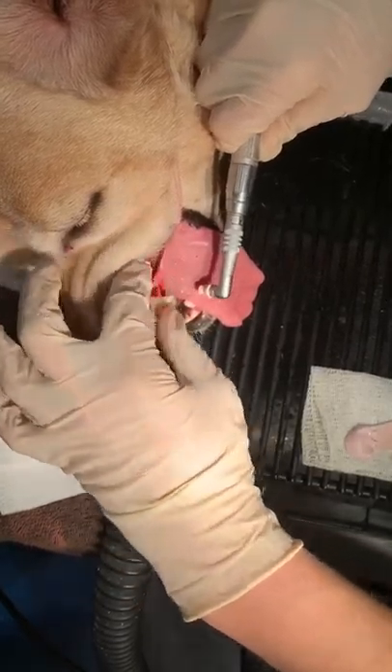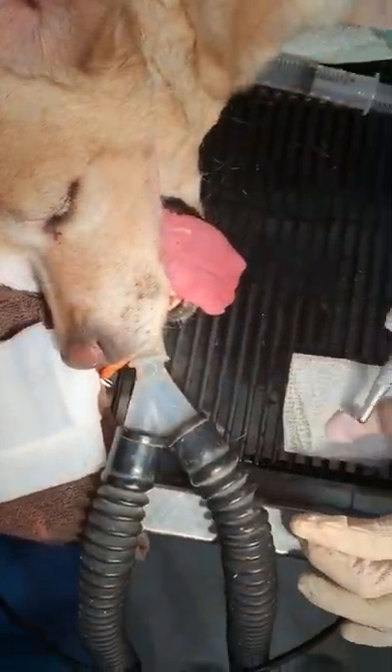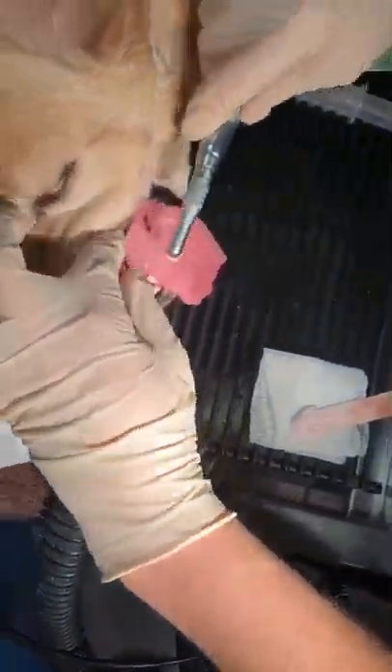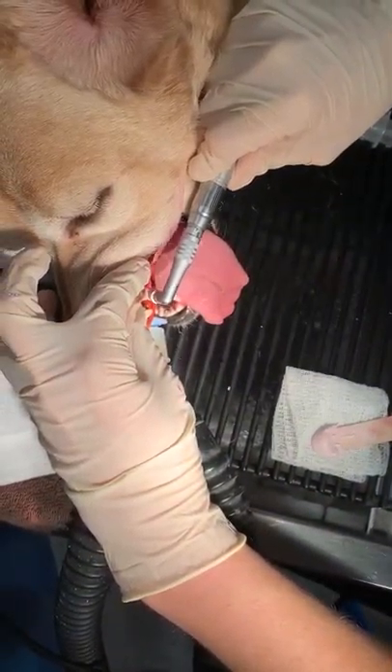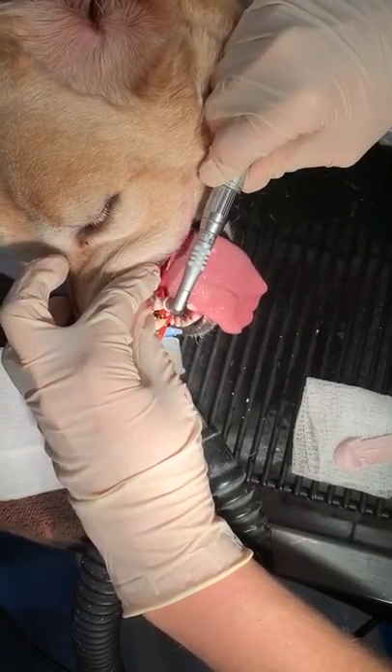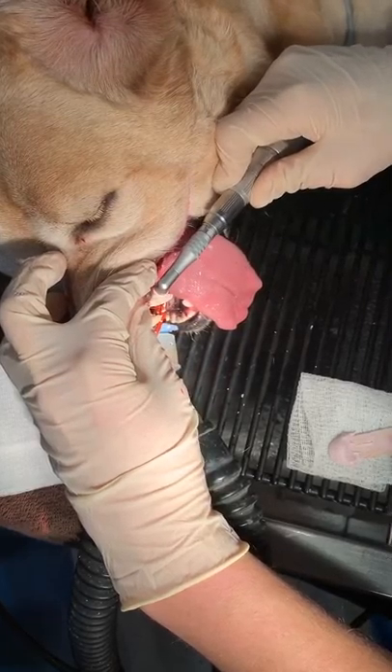You can put the polish in as nicely as you want — it's still probably going to fling polish all over the place. We're also avoiding that tooth because it's going to come out. Here we go.